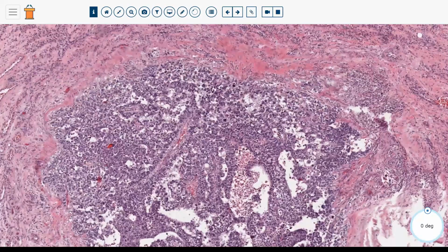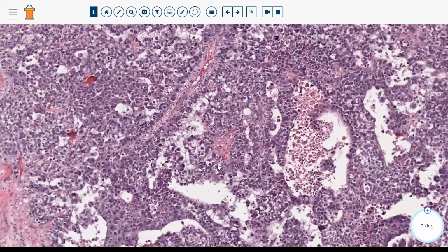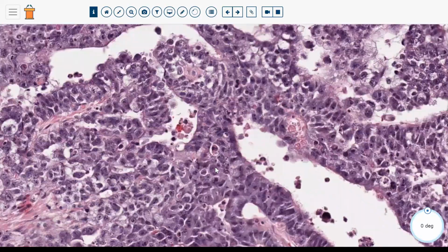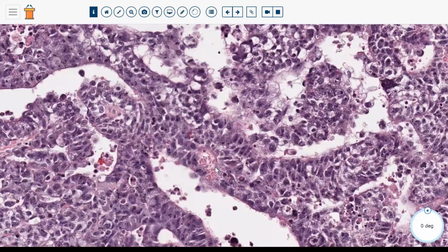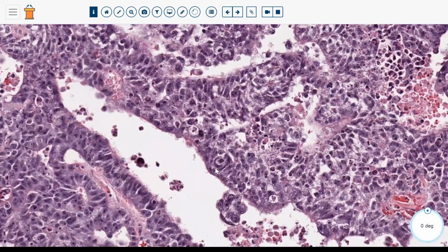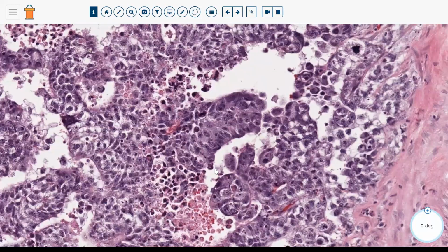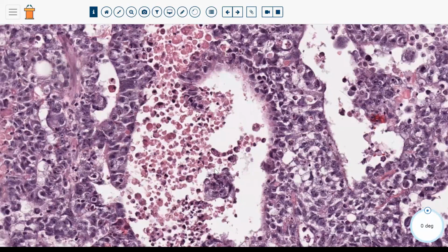If we go back over here again, you can see some glandular formations in the embryonal carcinoma. So embryonal carcinoma, again, a few takeaways are that it frequently has glandular formation, as you can see here, frequently has more nuclear overlapping and crowding, sometimes more than one nucleolus, and usually more of a basophilic appearance at low magnification, and it can have glandular, papillary, and multiple patterns.